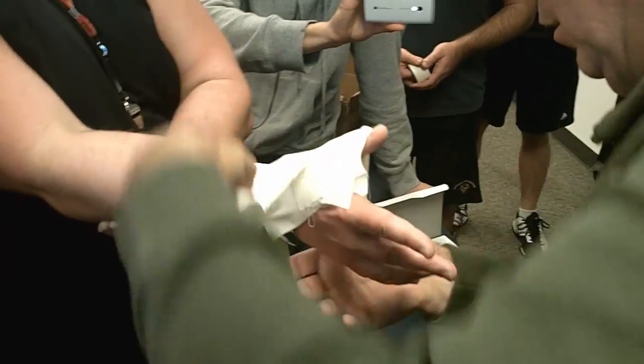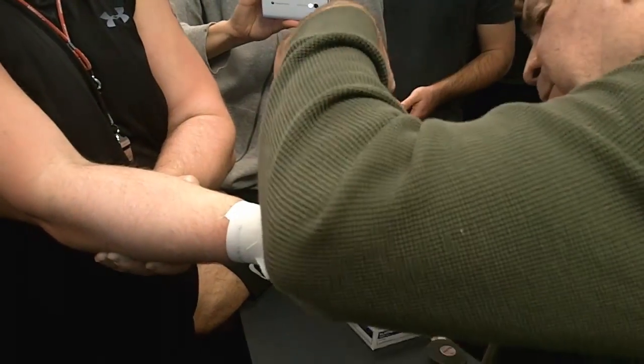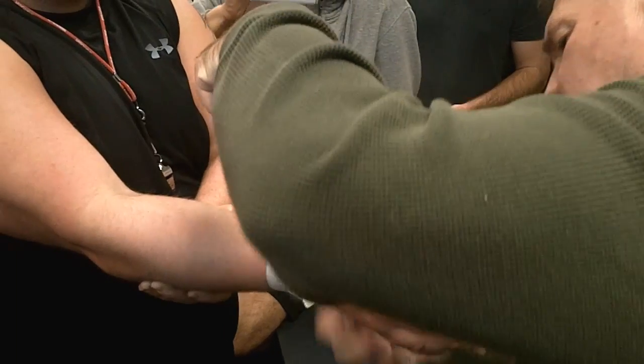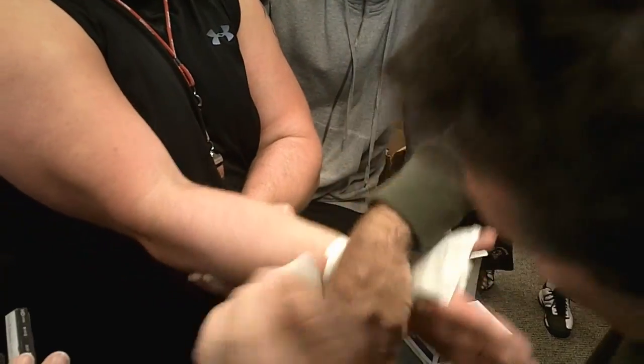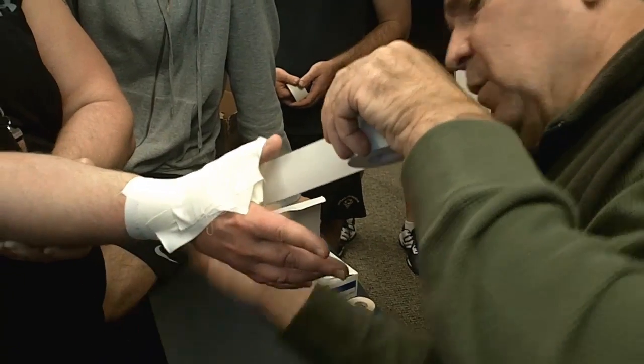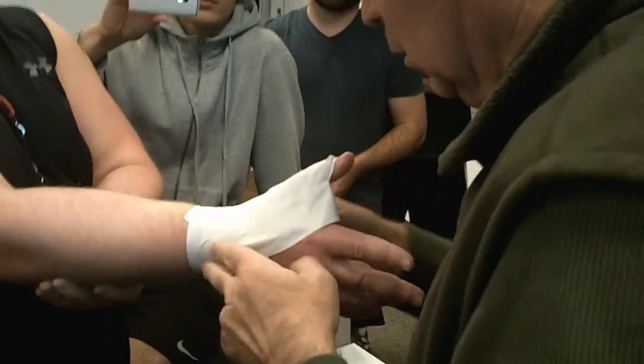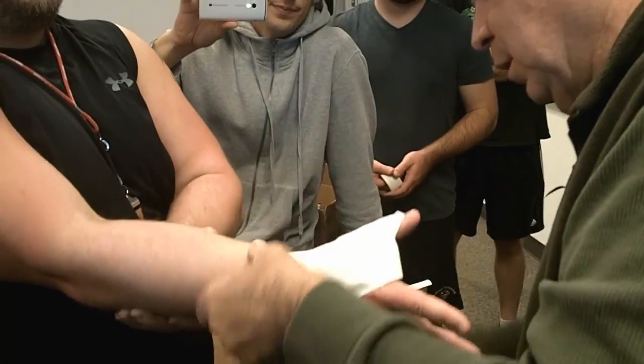Overlap it again — I can pinch up. I need to pull it tight. Take it all the way back. Cover my tape ends, come through my webspace.